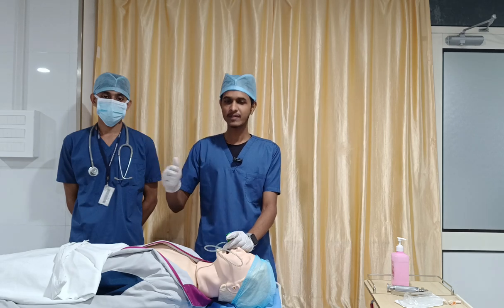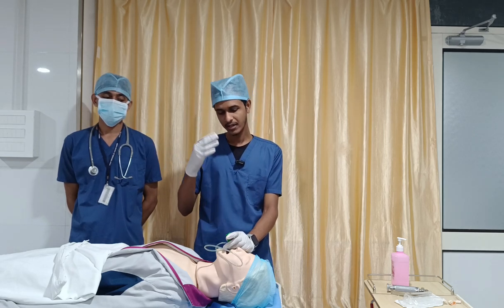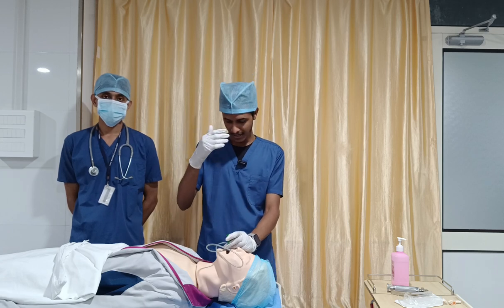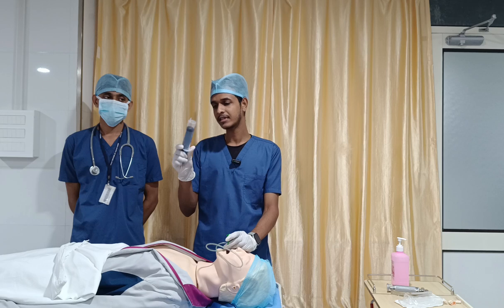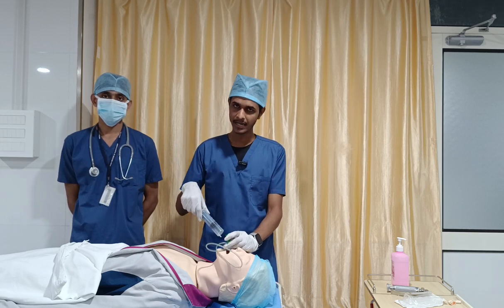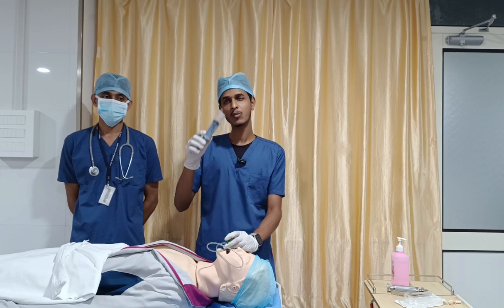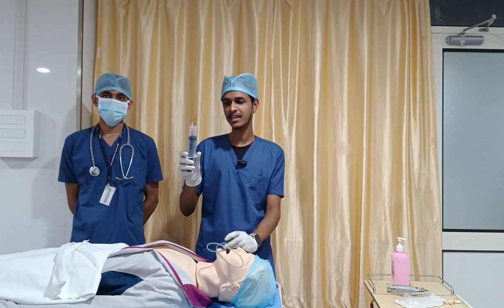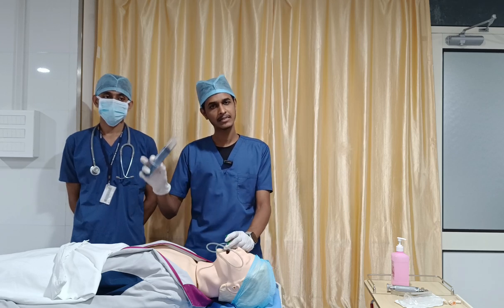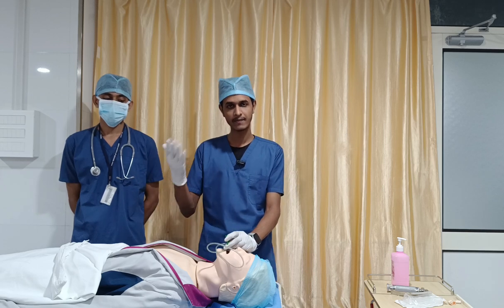Third thing, you can go with the definitive confirmation, that is an X-ray. Fourth thing, this is what I referred to in UpToDate. You can take around 30 to 40 ml of water and inject it into the Ryles tube. Immediately you have to take back that water. If you are retaining more than 70% of the water, you can confirm that it is in the gastric content. This is a reference from UpToDate.